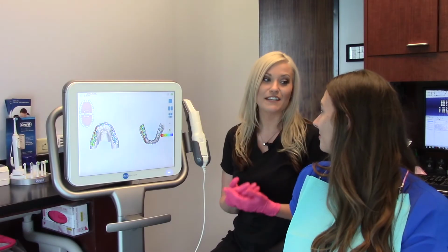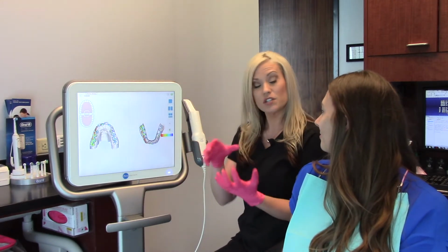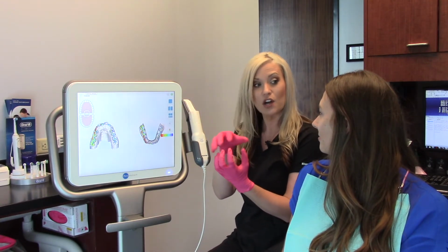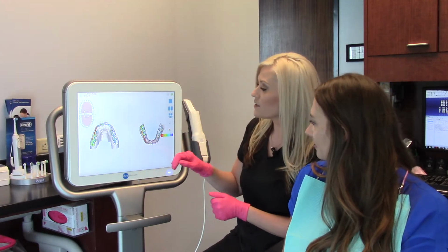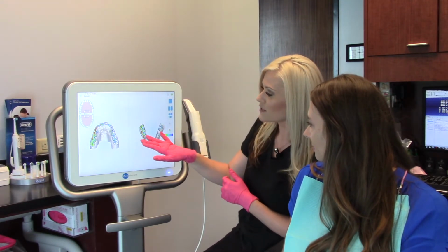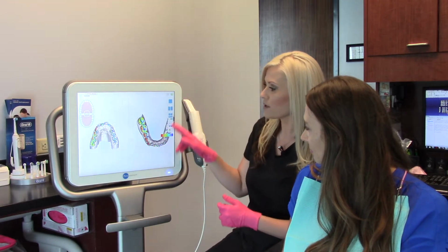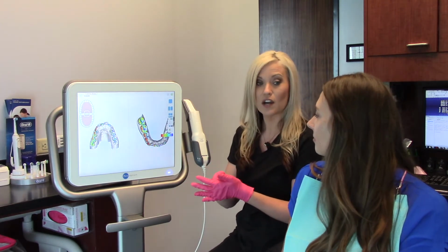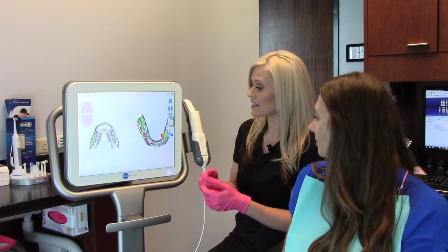Our iTero scanner has many amazing features. This is something we call the occlusogram. Occlusion is the way your teeth come together, so it shows us which sides are hitting harder than others and where you're putting the majority of your wear and tear. So as you can see here, we all kind of know red, we associate red as bad, but as you see here, we can zoom in and show you. This is going to be your top arch and this is going to be your bottom. Where the red is where you're putting a lot of wear and tear. So it may be in the evening when you're grinding, clenching, all these different things.